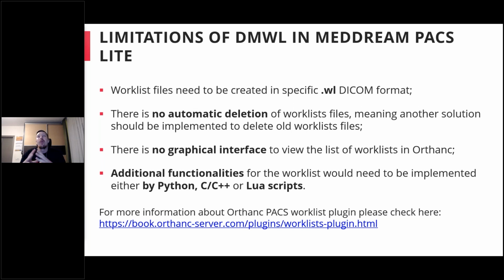And I want to mention that Orthanc PACS and this worklist plugin are not developed by Softneta. So we are not developers of this plugin or of Orthanc PACS. So for all the information, please check the official website of this plugin and the official website of Orthanc. Also, there is a quite active Google group of Orthanc users, so you can always find some information there. And that's it for what I wanted to say about the PACS Lite.